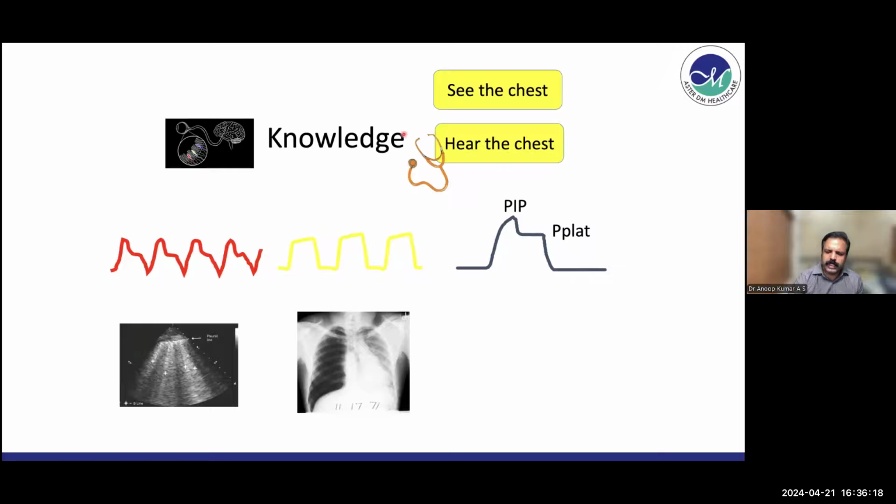And again, see how the sequence is developing. If you have a bedside chart, like I've shown you in previous situations, see how the hypoxia was gradually increasing, whether the pressure monitoring was gradually increasing. So you have to take a proper history. You have to thoroughly go through the charts and data, and you have to test the patient, feel the patient, and you have to examine before taking this ultrasound probe or any other investigations.